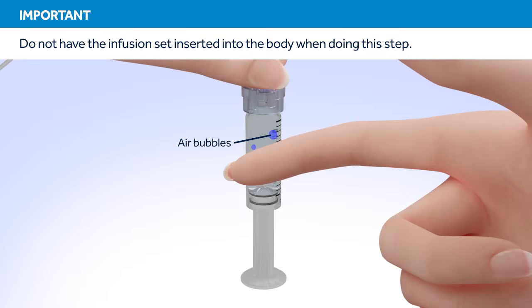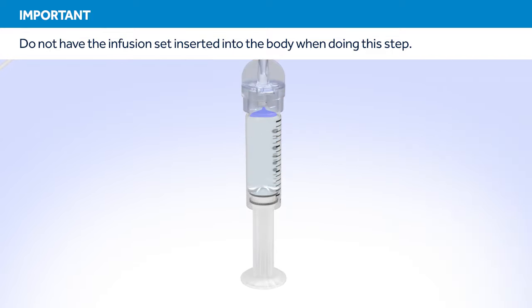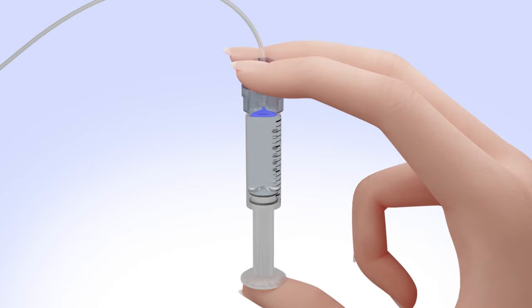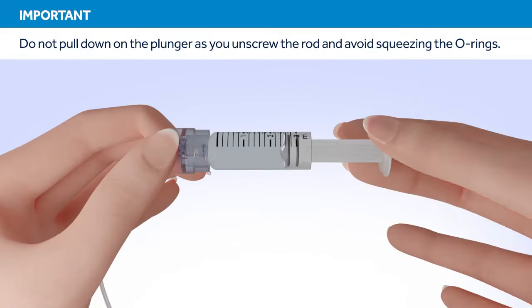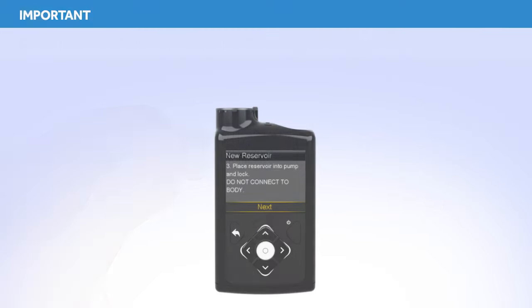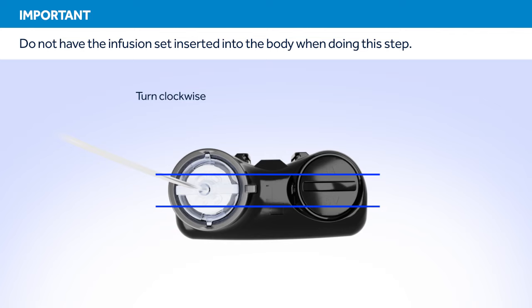Tap the reservoir to make any air bubbles rise to the top of the reservoir. Purge the air bubbles that have risen to the top by slowly pushing up on the plunger until all of the air bubbles have been pushed out of the reservoir and you see a small amount of insulin in the tubing. If you're not able to push insulin into the tubing, disconnect the tubing connector and then reconnect it. Unscrew the plunger rod counterclockwise until it completely separates from the reservoir. Put the reservoir in the pump and turn the tubing connector clockwise until you feel the reservoir lock into place.